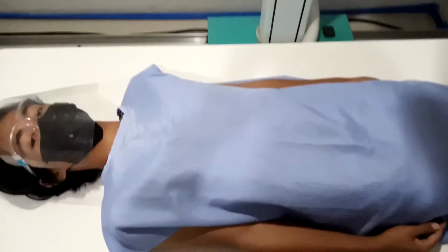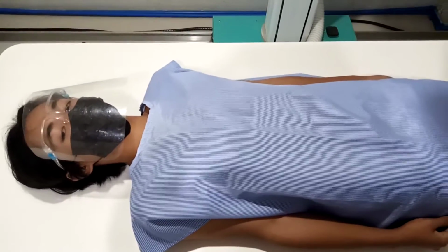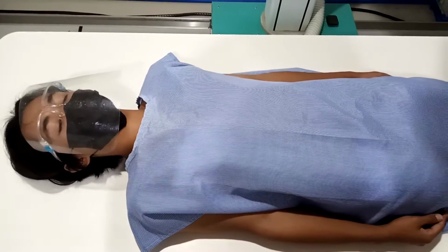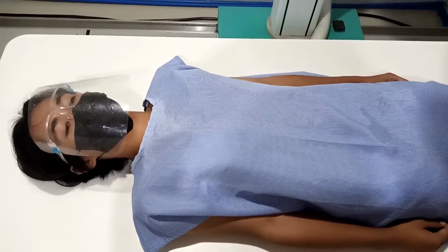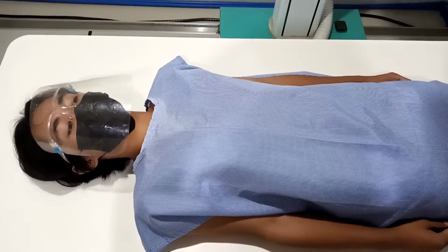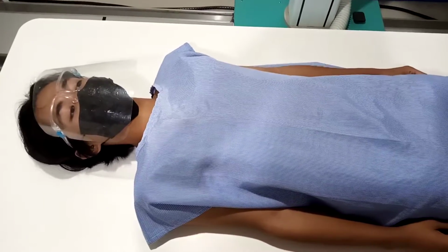First, we're going to demonstrate the cervical vertebrae, AP axial. So have the patient positioned upright or supine. In this video, the patient will be positioned in a supine position. For positioning, center the mid-sagittal plane to the IR. Have the patient place the arms at the sides.